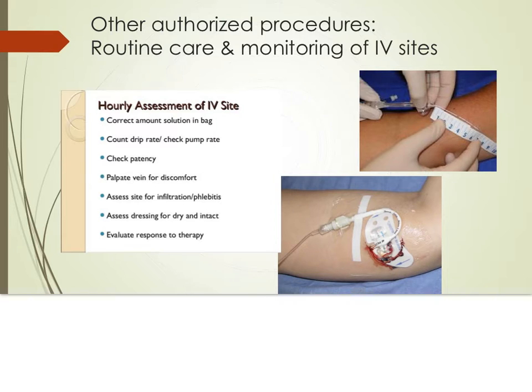The dressing should be assessed to make sure it is dry and intact, and the tubing connections checked and lines traced to their origin. Vital signs should be assessed, especially blood pressure, pulse, and temperature. Daily weights and I's and O's should be documented and monitored.